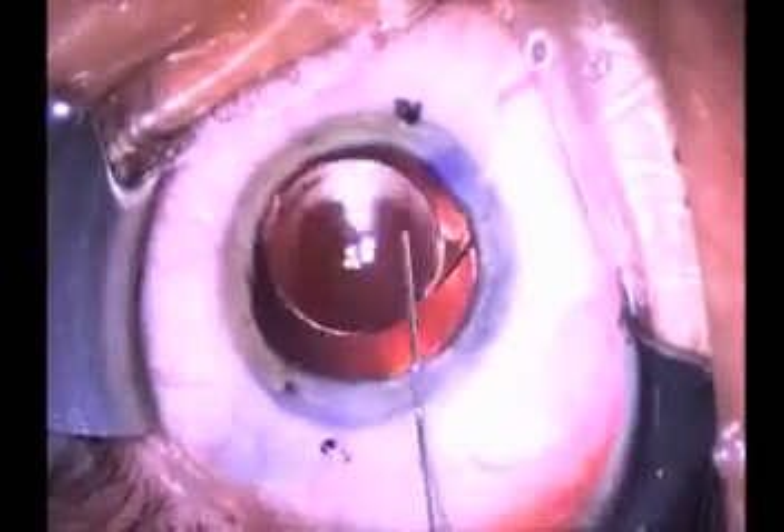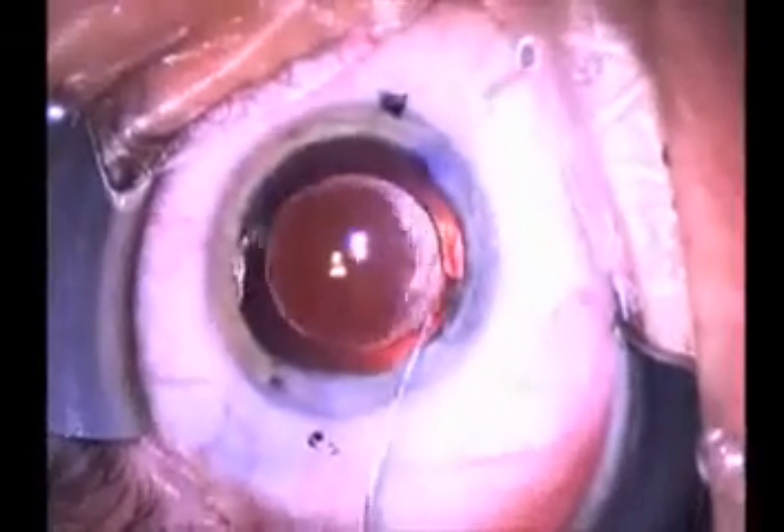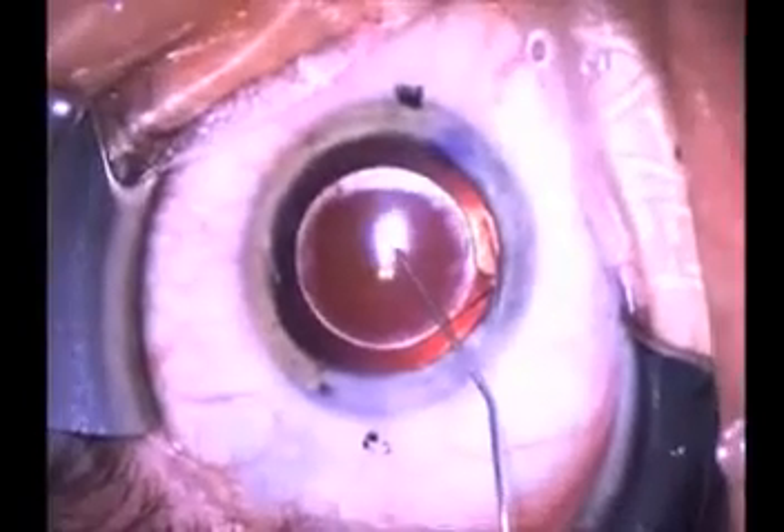Those marks are placed on the steep direction of the cornea. And the hash marks on the lens are correcting the astigmatism in that orientation.